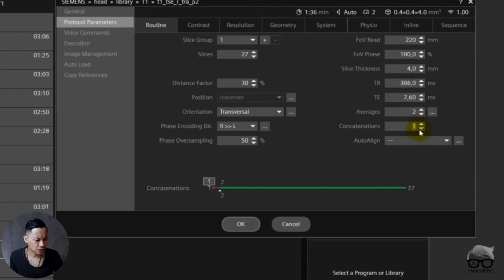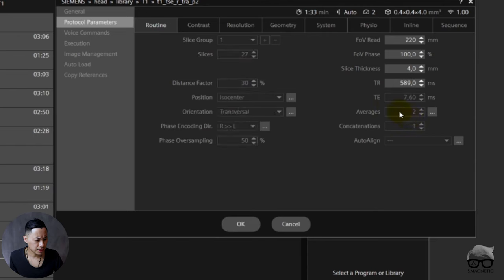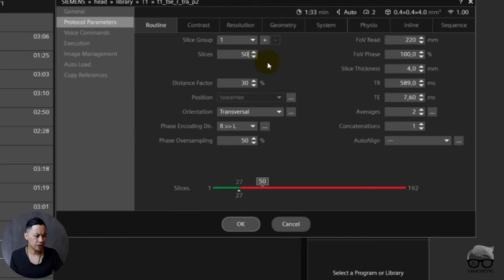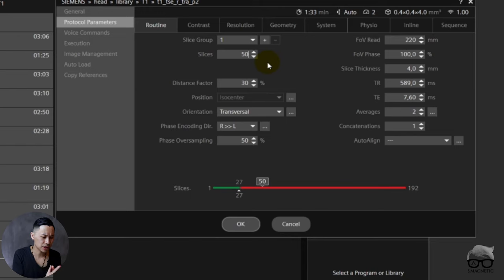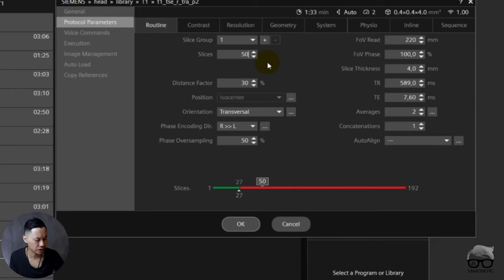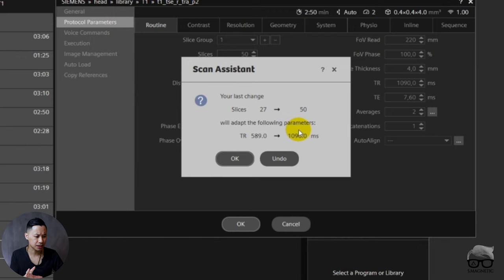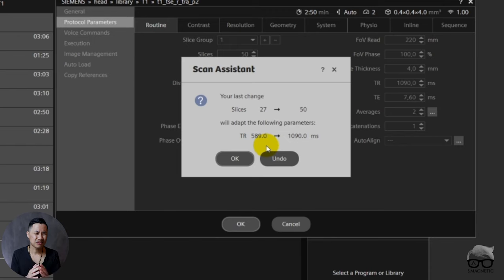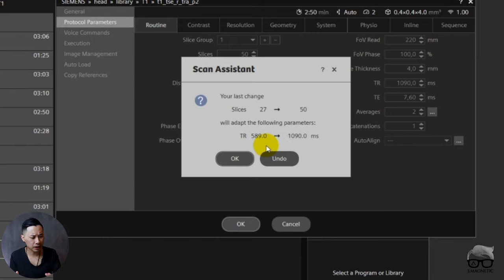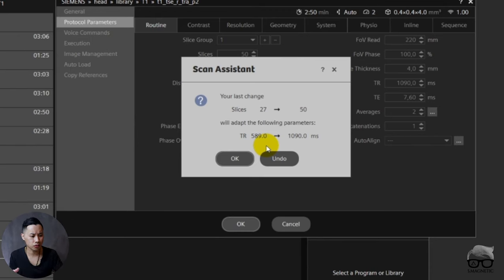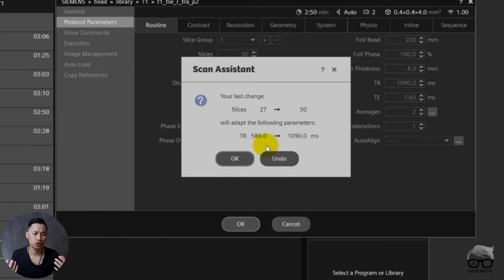So let's take this T1 and let's say we go to one concat. And let's say you have now 589. With 589 you're maxing it out. You cannot have more slices. 27 slices is the maximum. We want to increase this to 50. We want to have a big coverage. So what happens now? For me, for being able to have 50 slices, it says to me now, hey, you have to increase the TR from almost 600 to 1000. I find this a little bit too high. I want to lower it a little bit. Imagine if this was a 1.5T, way too high. So we need to lower the TR but we don't want to lose the slices.